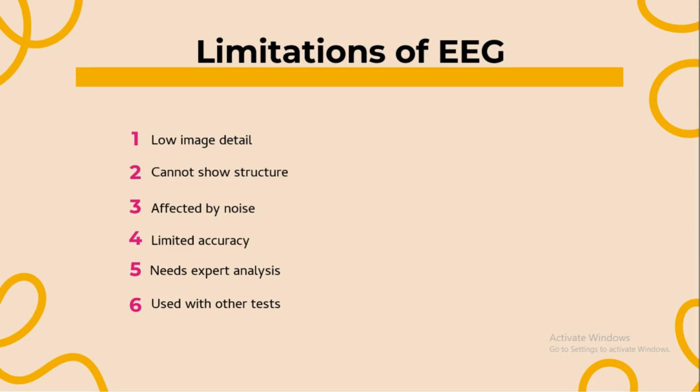There are also some limitations of the EEG. For example, low image detail, it cannot show the structure, it is affected by noise, and it has limited accuracy, needs expert analysis, and is used along with other tests.